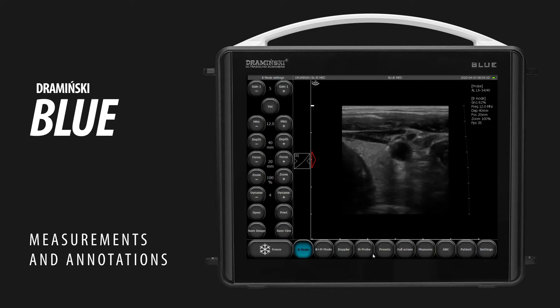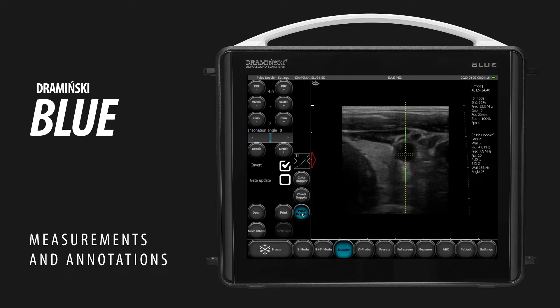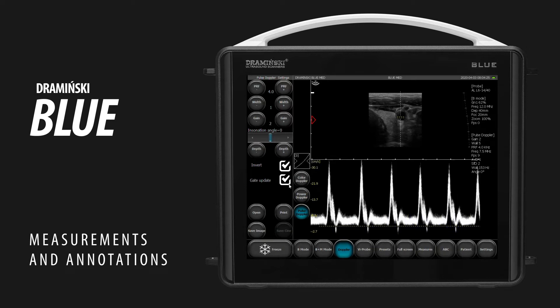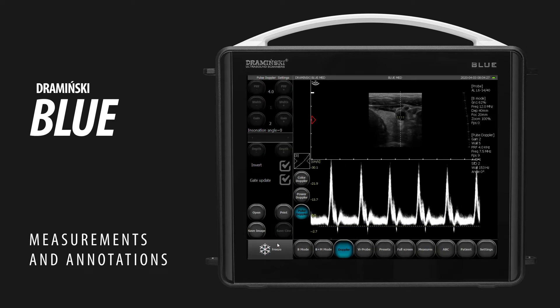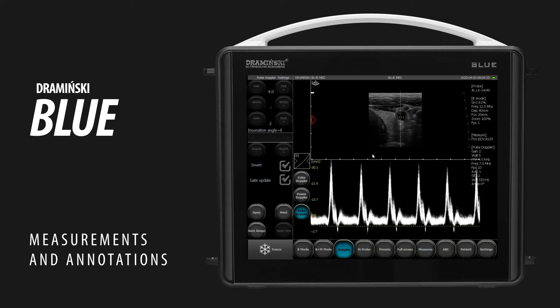The Doppler measurements will be available after the Pulse Wave Doppler mode has been activated. To measure resistive and pulsatile index, freeze an image in the Pulse Wave Doppler mode and enter the measures menu. Choose RI, PI, PSV, EDV and put a measuring point on the Doppler spectrum.